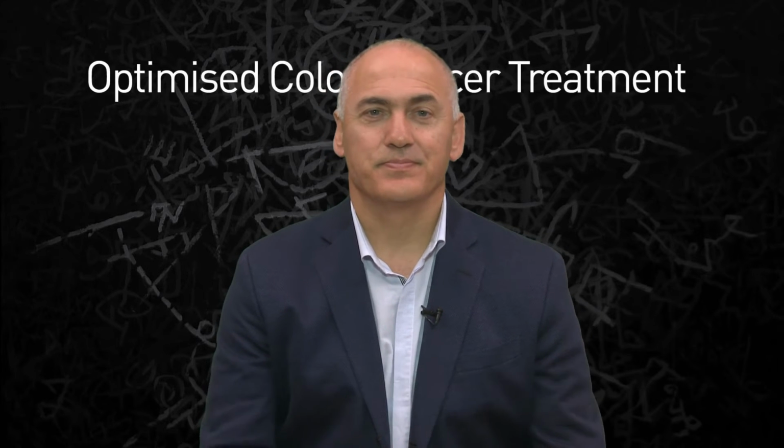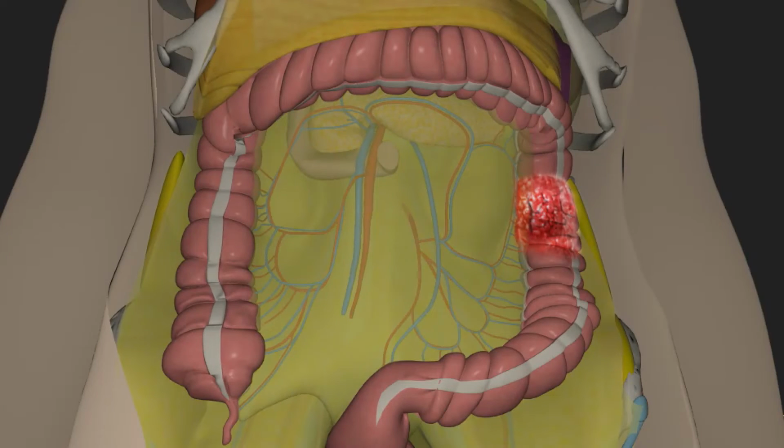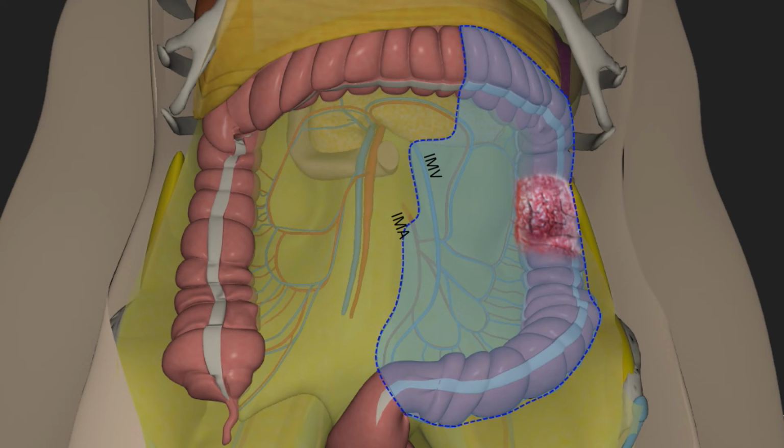Now I'll describe the minimally invasive approach to descending colon carcinoma. As mentioned previously, the extent of lymph node dissection for descending colon carcinoma is different from splenic flexural carcinoma. This figure represents the surgical dissection margins. There is no need to remove the omentum if the descending colon carcinoma is located 10 to 15 cm away from these structures, unless there is a direct invasion.